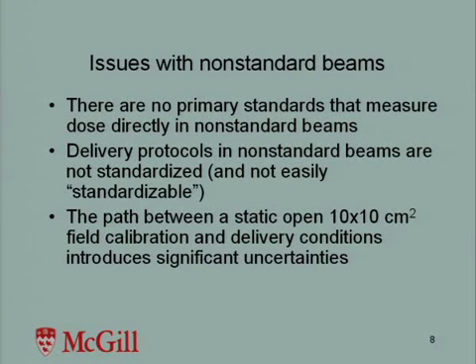And what is currently happening is that for the devices that can realize 10 by 10, the connection between the 10 by 10 field and the delivery conditions is made basically by the treatment planning dose calculation algorithm, and so that introduces some uncertainties.